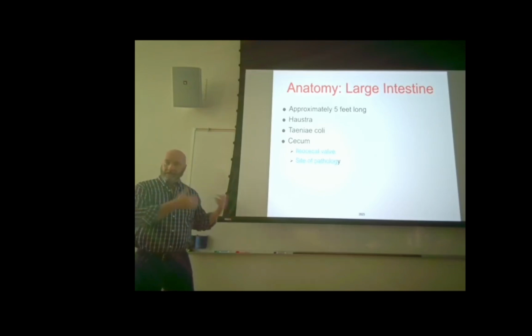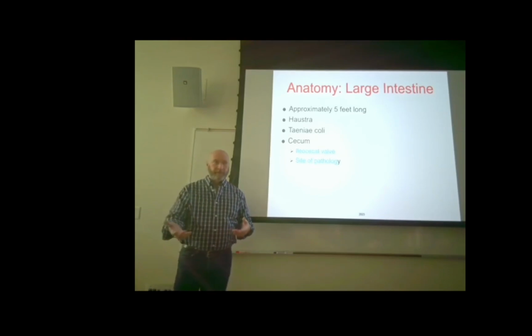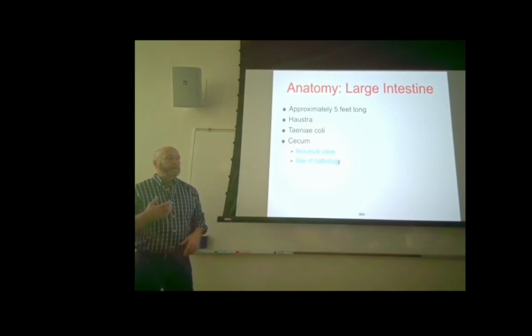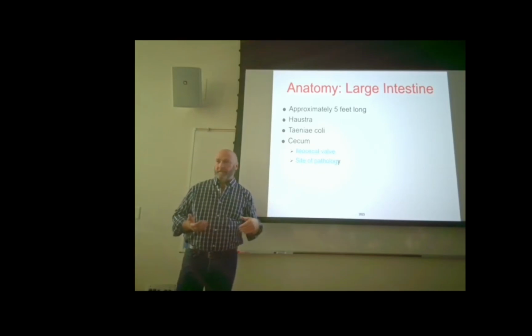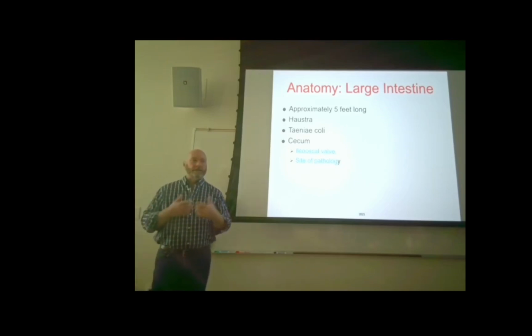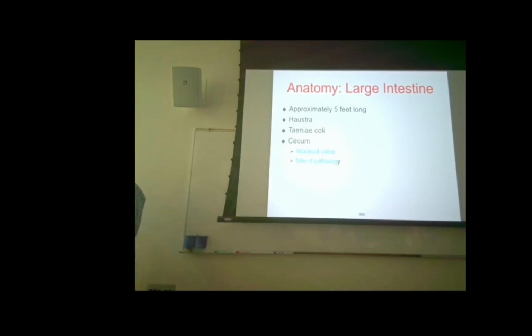If the patient's going to surgery, there's probably going to be some spillage when they go to remove the appendix that's inflamed. So there is a possibility you'll go to work somewhere where they'll do gastrografin enemas for suspected appendicitis. If the appendix is inflamed, then you may see it much larger than what it should be. If it's not inflamed, then when barium or the gastrografin gets down inside of it, it's no larger than a pencil. Not a pencil marking, but the pencil itself.